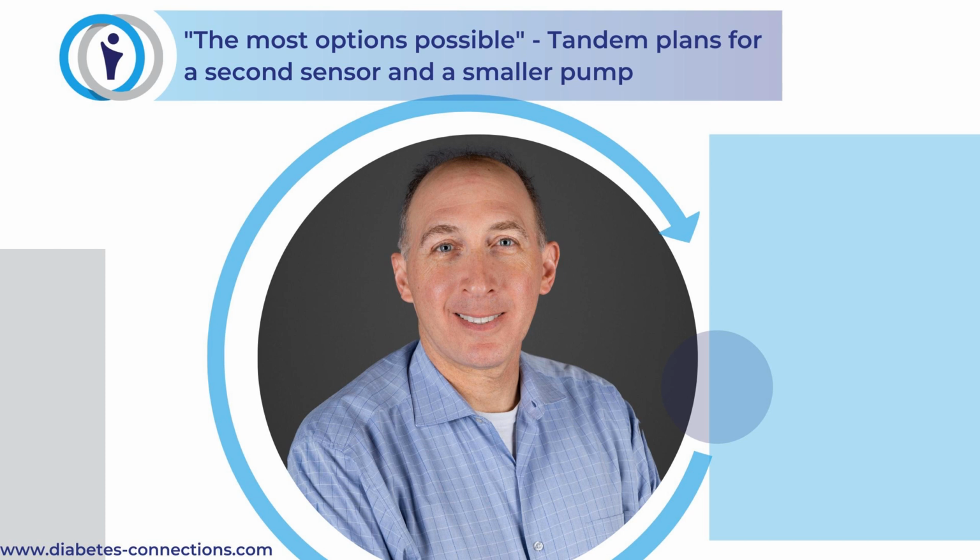The other thing to think about is how much easier this made this for physicians who you might be seeing in clinic. Because now people are really using the mobile app and leaving it open and not swiping it away on their phone, it uploads in the background at regular intervals. All the data your doctor might want is there when you come into clinic. I foresee the end of the days where someone has to say, oh, we're struggling to download the pump, wait a little more in the waiting room, right? Your doctor already has all this information. They could spend more time talking to you and less time trying to get the information off of it.